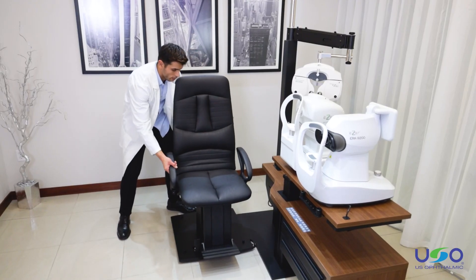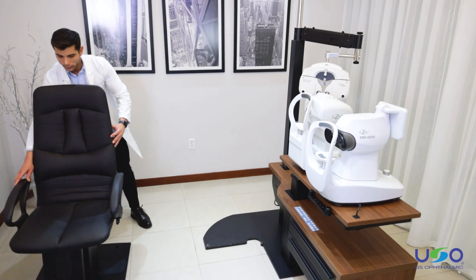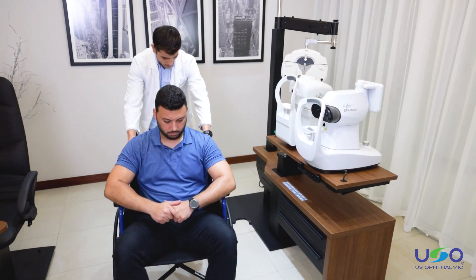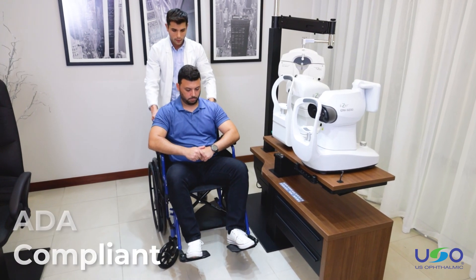The chair in its entirety can also be completely removed. These adjustable features of the table and chair are helpful for disabled patients, patients in wheelchairs, and patients of all body types, and make the Venetia an ADA compliant unit.